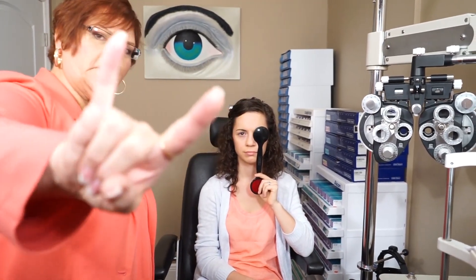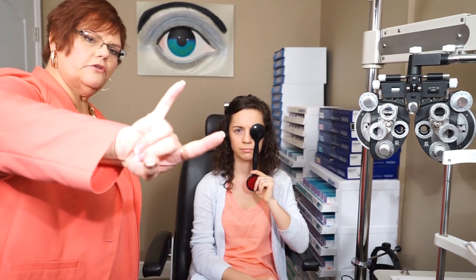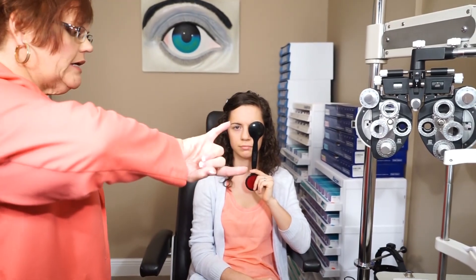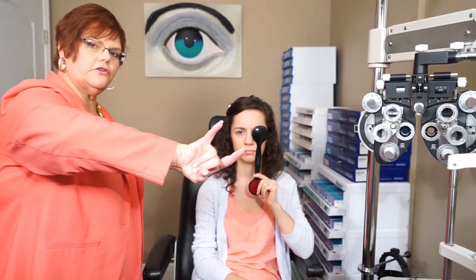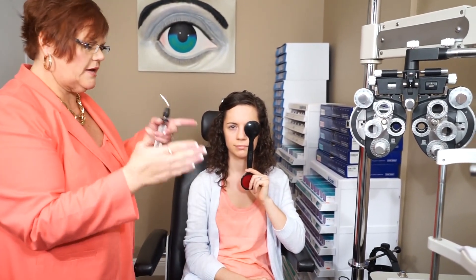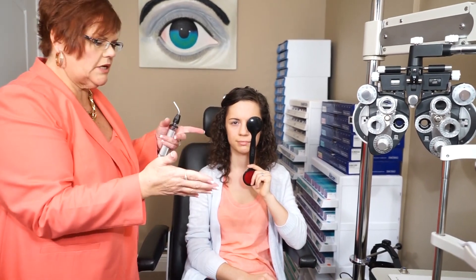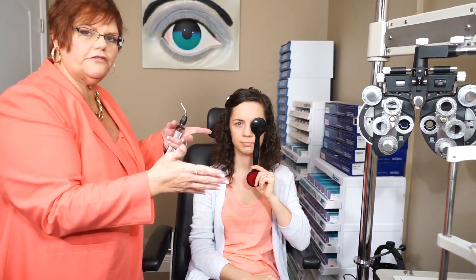If she can't count my fingers from the end of the room, I'm going to slowly move a little bit closer and a little bit closer to her until she can. Let's say she can tell there are two fingers when I'm up close — it would be documented as count fingers at that distance, let's say 1 foot.